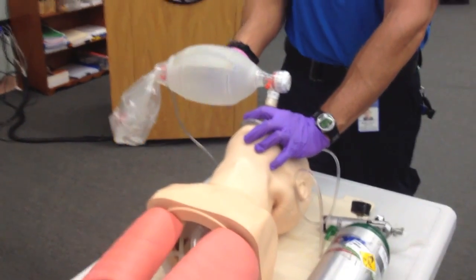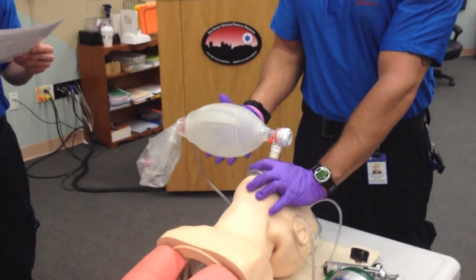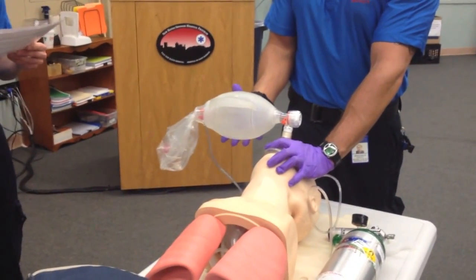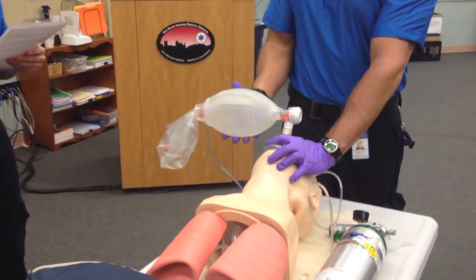How would you know if you are delivering adequate volumes with each ventilation? With each ventilation, I'm looking for equal and bilateral chest rise and fall. I have successfully completed this station.